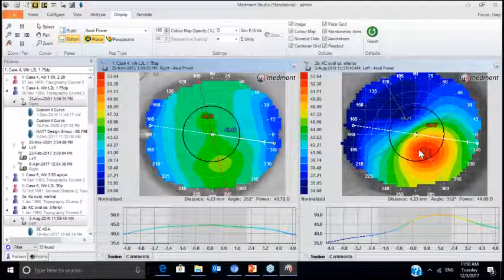And boy, Nikki, as you said, this is the limiting factor of K readings. In the normal eye, the eye is probably pretty consistent in the way it flattens. When we have two distinct meridians of curvature, a flat and a defined steep meridian, it's pretty straightforward to guess the first contact lens that we need.